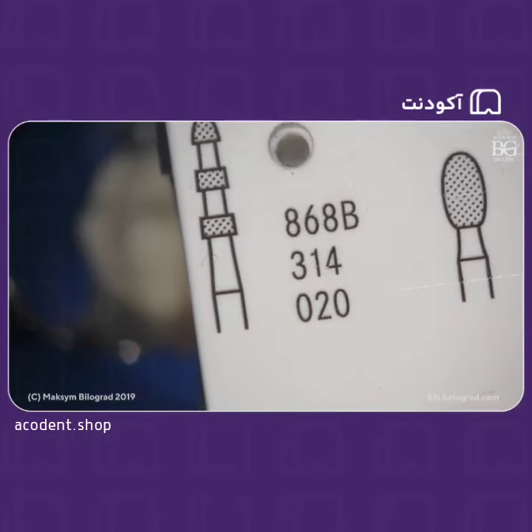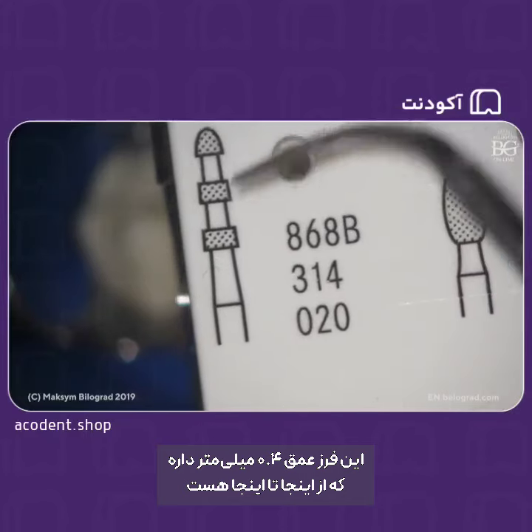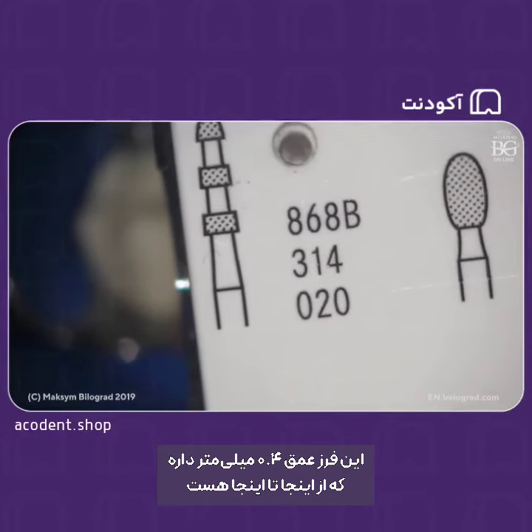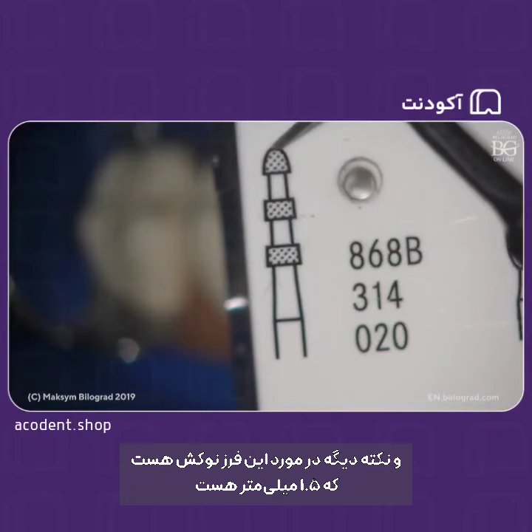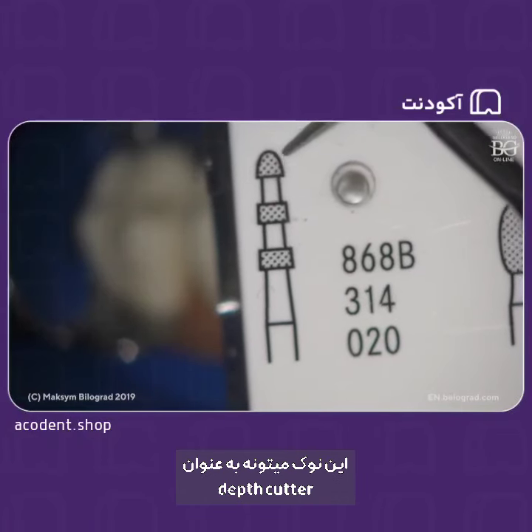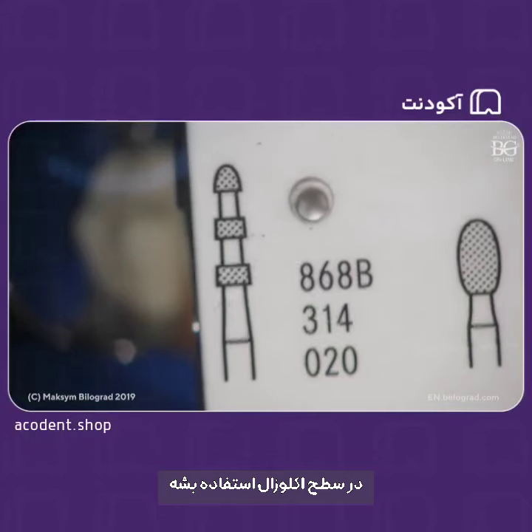This one has a depth of 0.4. The ledge here is 0.4. The good thing about this burr is that the tip here is 1.5 millimeters. This tip can be utilized as a depth cutter for the occlusal surface, for example.